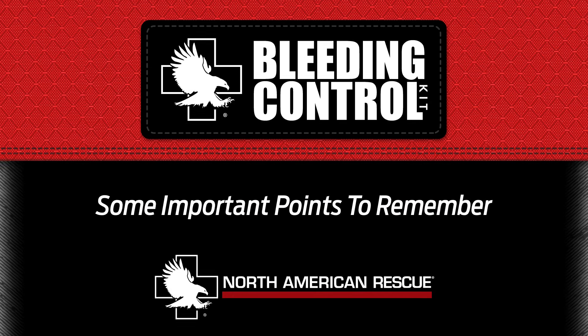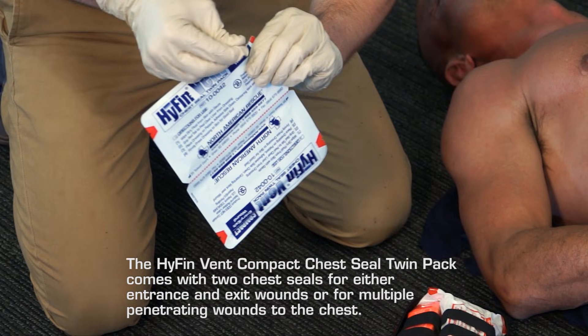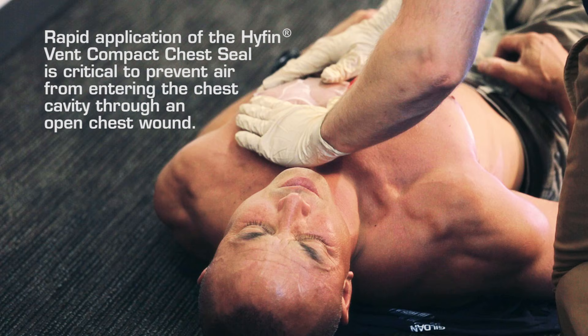These are some important points to remember. The Hyfin Vent Compact Chest Seal twin pack comes with two chest seals for either entrance and exit wounds or for multiple penetrating wounds to the chest. You can also save the packaging material as it may serve as an occlusive dressing for other chest injuries if needed. Rapid application of the Hyfin Vent Compact Chest Seal is critical to prevent air from entering the chest cavity through an open chest wound.